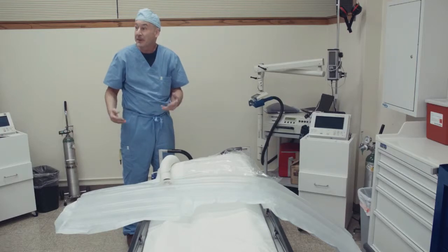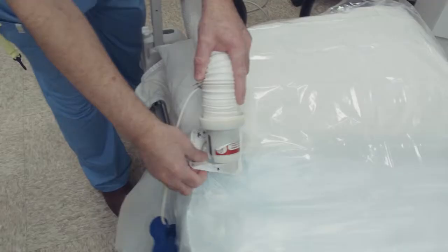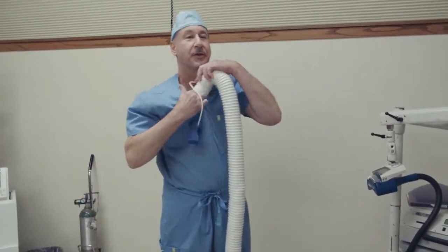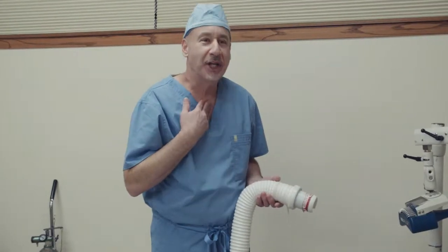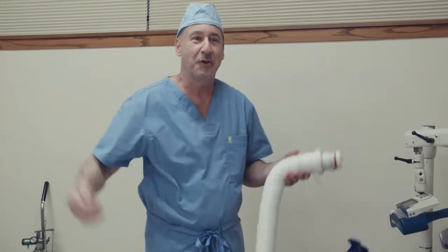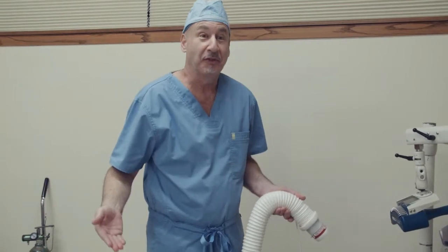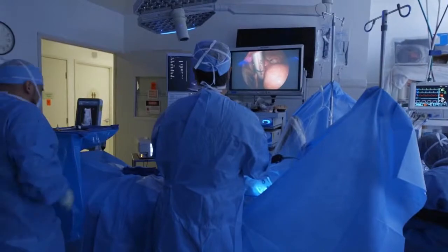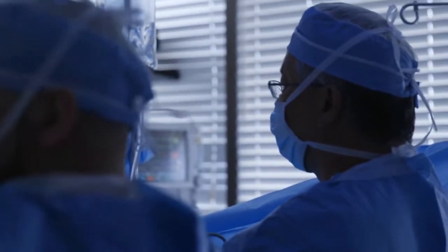But Dr. Silverberg believes the Bair Hugger really causes infections another way. He says shivering OR staff routinely put the device's hose under their scrubs to warm themselves. If you're taking your shed skin cells, which are covered in bacteria, and having them float out throughout the operating room, there's a very good chance that these are landing in the surgical wound. Dr. Silverberg says even though some hospitals have banned the practice, it still goes on.